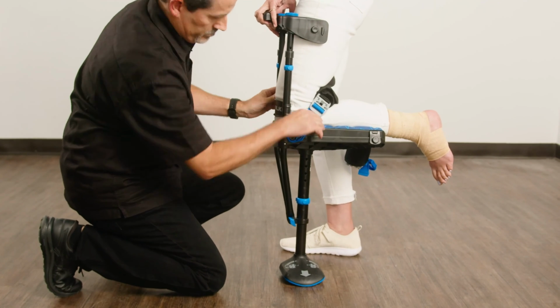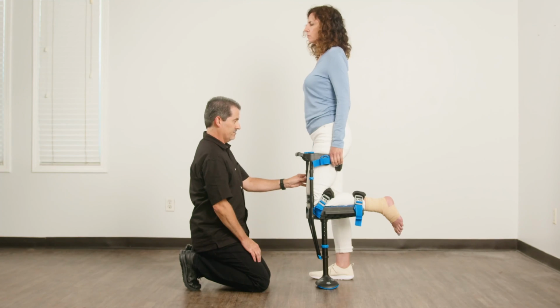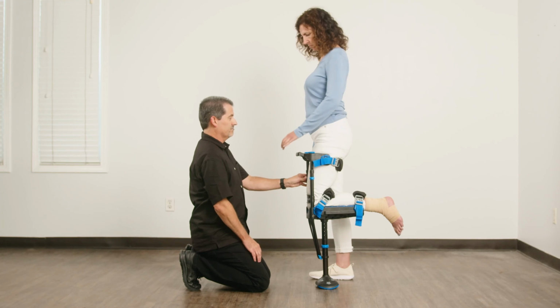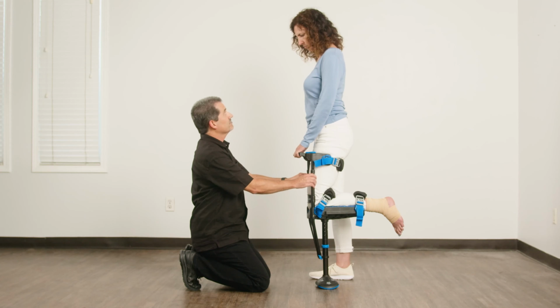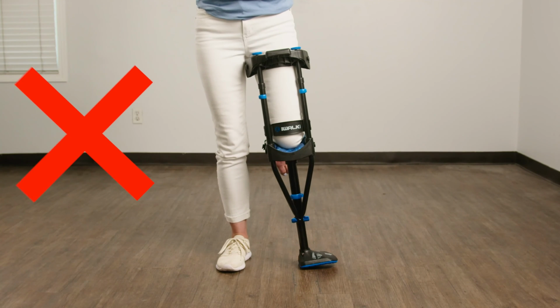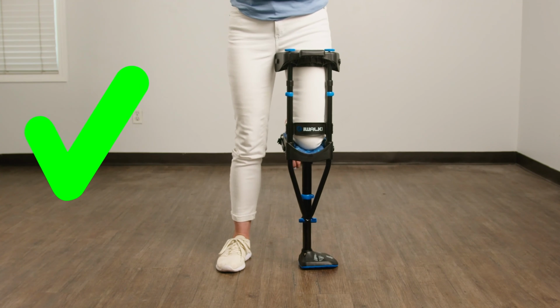Training exercises. Put the crutch back on the patient. Remain kneeling directly in front of the patient during these exercises. This prevents them from trying to walk prematurely and allows you to assist if they lose balance. Position them with their feet side by side, hip width apart, with weight distributed evenly on both legs.